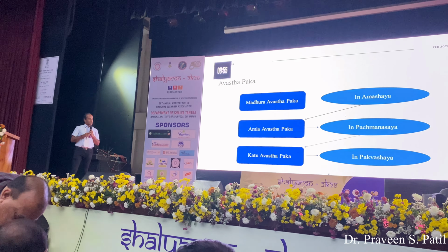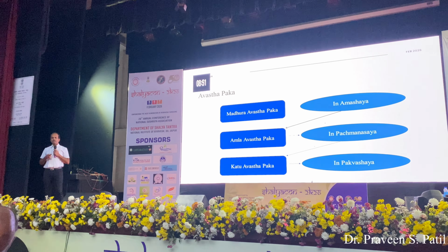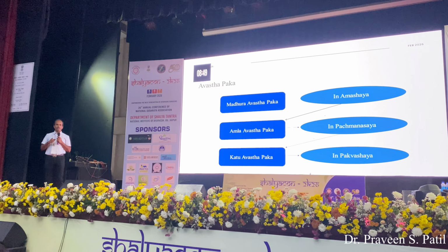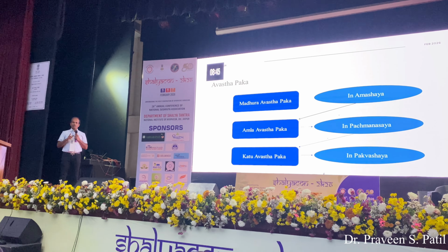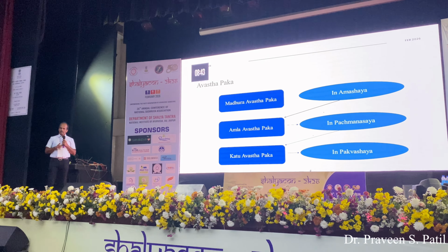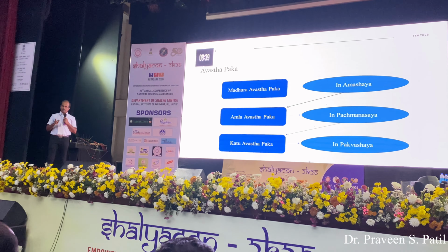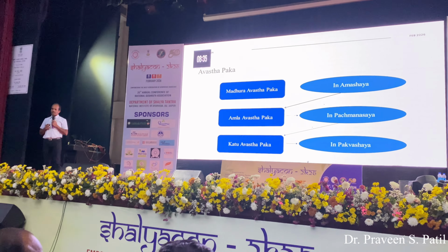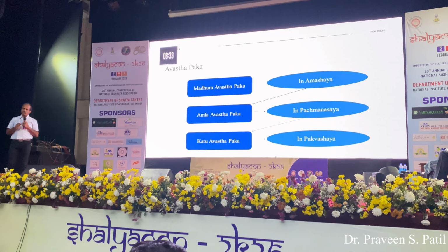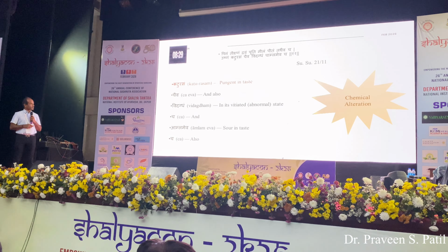See, that generation of Amla Rasa in Amashya could be because of a disproportion between the required amount of Pitta and the food, or an altered chemical constitution, or else an altered anatomy of the Amashya. To know this, we would definitely require a scope or Nadiyantra.